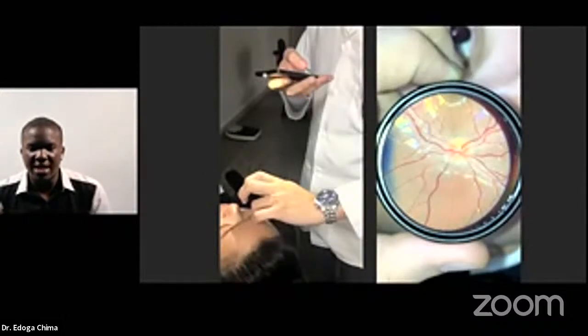Then the third thing that you get by a patient lying down is that the free hand, the hand of the ophthalmologist holding the lens, is not against gravity. Yes, Dr. Ada, if you stay at the head of the patient, the images will not be inverted and you'll be seeing it as if you are doing a direct ophthalmoscopy.